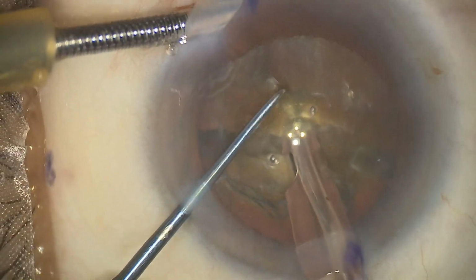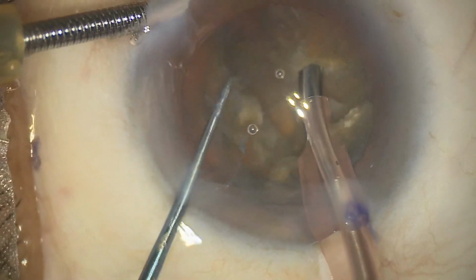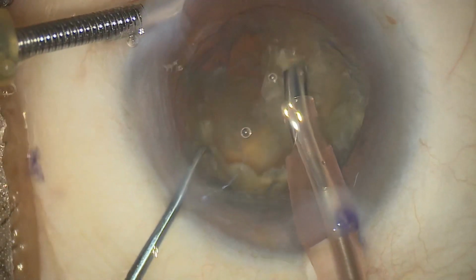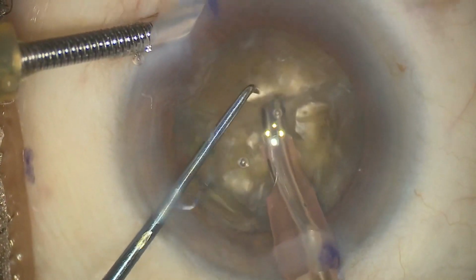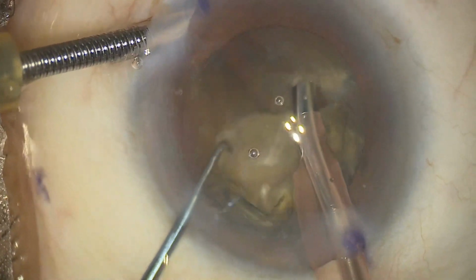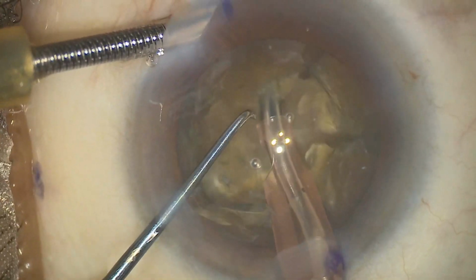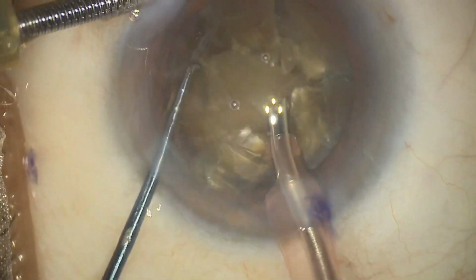Once I engage the phaco tip, I bring the chopper toward the phaco tip and break the nucleus into pieces, and this way you create 6 to 8 pieces of the nucleus in the same way, with lateral separation. While doing the lateral separation, you bring the chopper toward the phaco tip as well as with a downward movement.